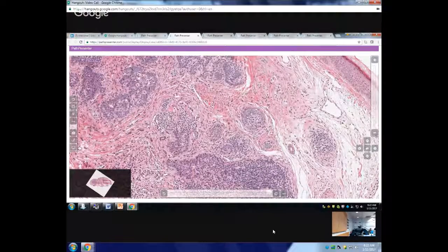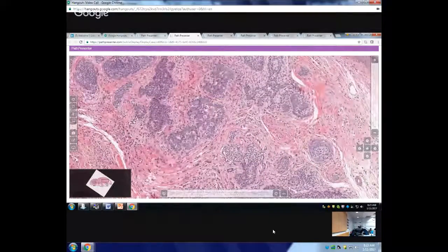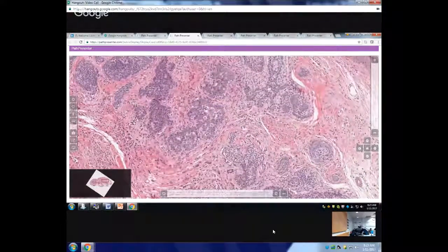Yeah, it does. This is known as the papillary mesenchymal body, and this is another characteristic feature that you're going to see in a trichoepithelioma. These terms are going to be new to you, but what you have to do is write notes down, look at these slides, and then go back, open up your books, and read about this. You can always come back to the slide, because these slides are available online anytime. You can come back and look at them.